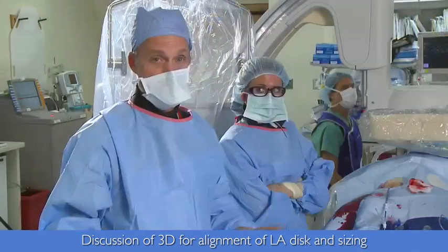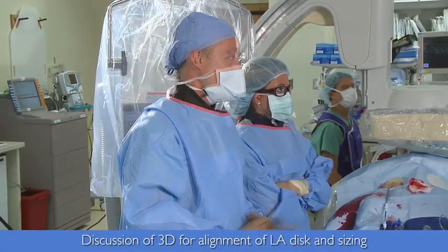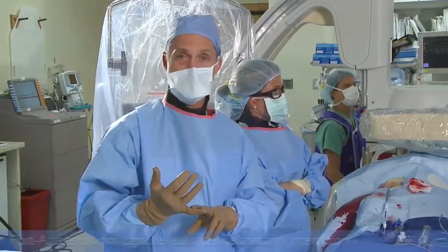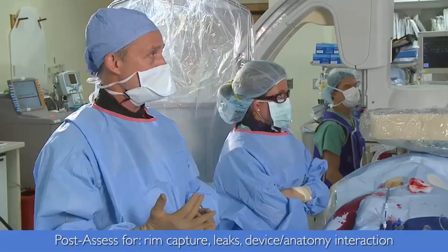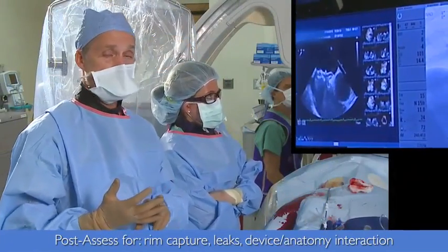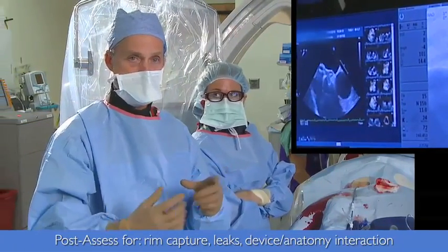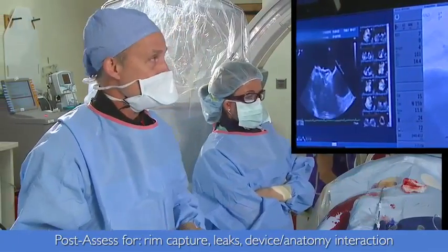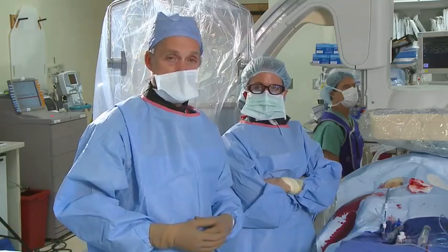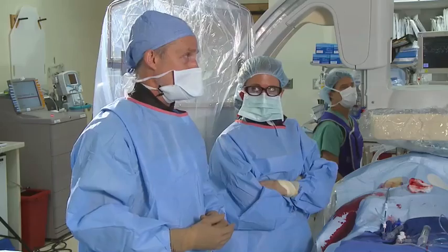In addition to the inherently better sizing of a defect and understanding the anatomy you get from the 3D imaging. So Dr. Quaife is now focusing in on number one, do we have rim capture? Number two, do we have any residual leaks? And number three, and very importantly, where are the edges of the left atrial disc and the right atrial disc? Are they pressing into any contiguous structures that would make us worry about a potential risk of erosion? Are they interfering with any adjacent structures like the AV valves and the pulmonary veins?